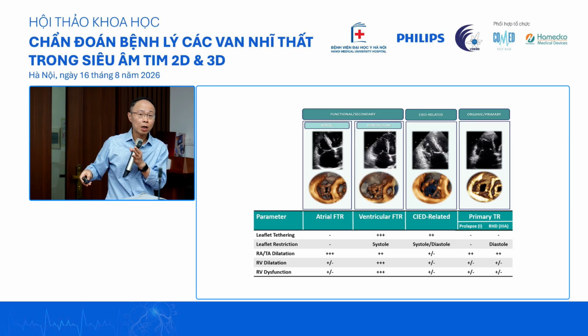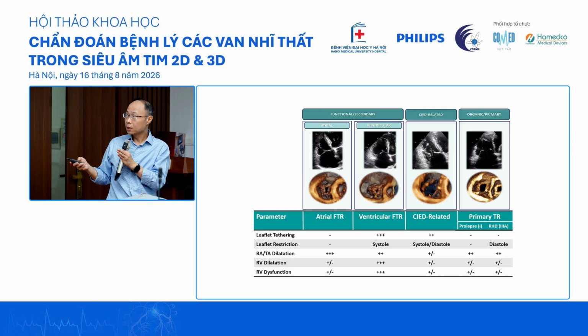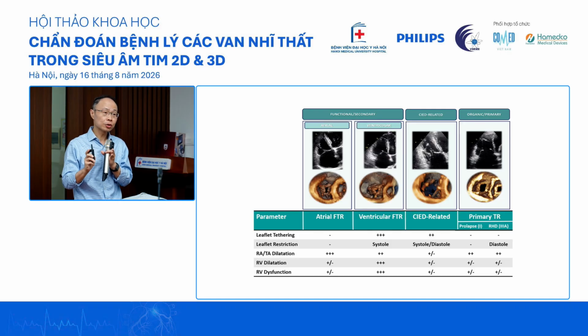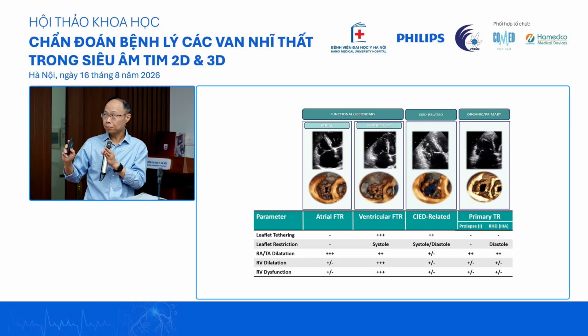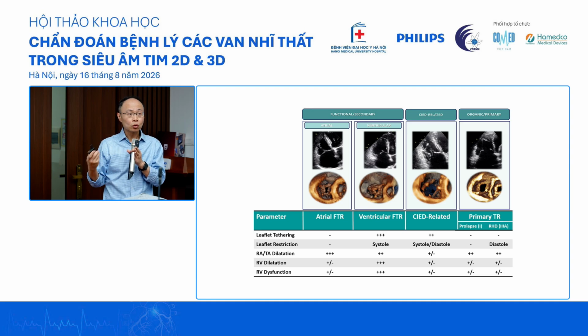So it's still possible. So when we do the transesophageal echo for the candidacy of tricuspid clip, these are things that we look out for. Again, if I may just summarize, we want to see an anterior and septal gap. We don't mind seeing a septal and posterior gap, but pretty much everything else, at least for our centers, we do not offer a clip.